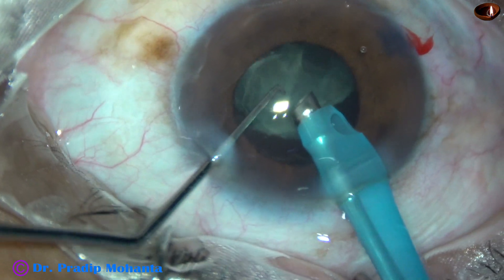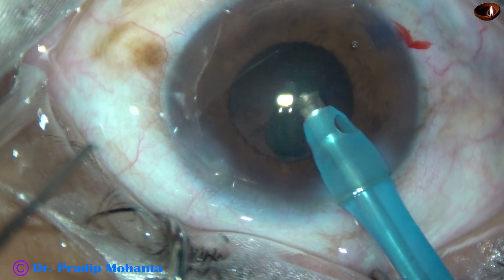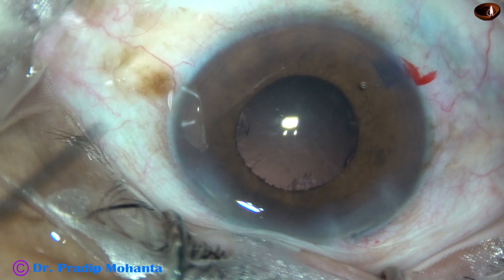This is the last portion of the nucleus. At this time, I removed the chopper to make the anterior chamber more stable. And the nucleus is managed.